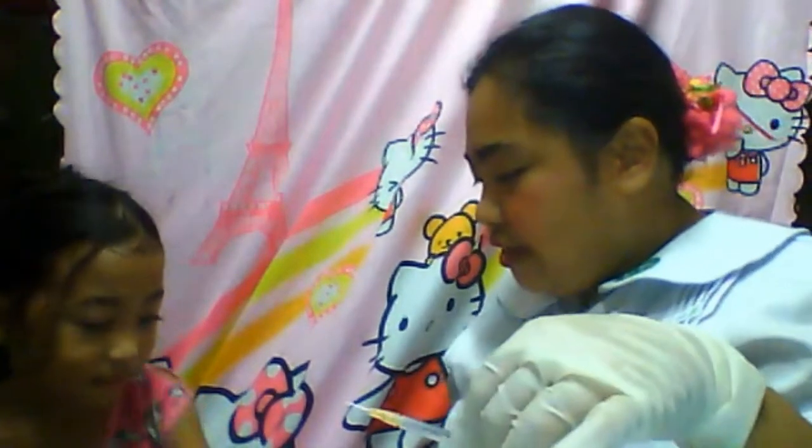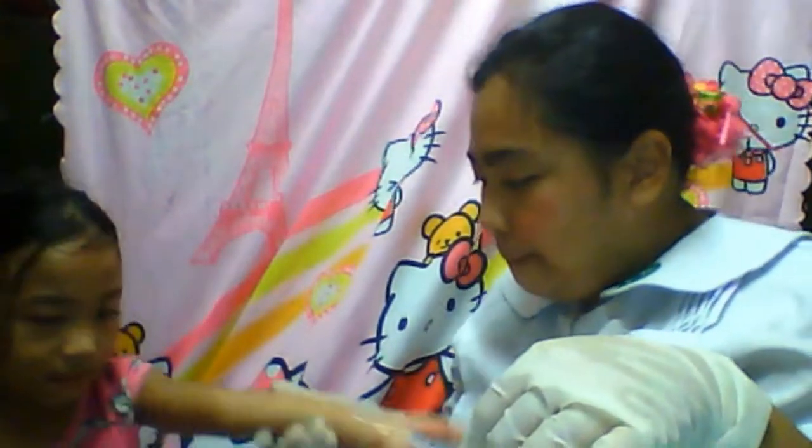Alright. And then we hold it like this, because again we will be having a 10 to 15 degree angle, so it's almost flat to the skin. Okay, and then while holding the patient's arm taut, we do it like this.